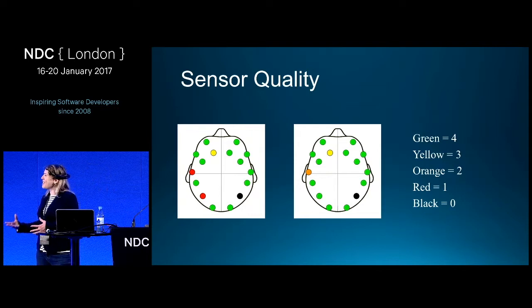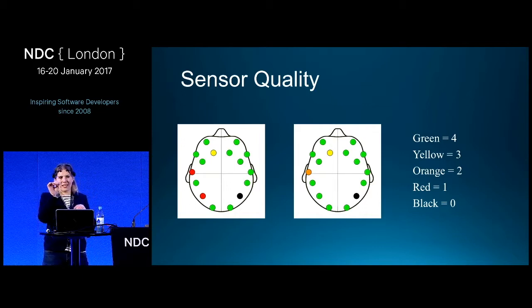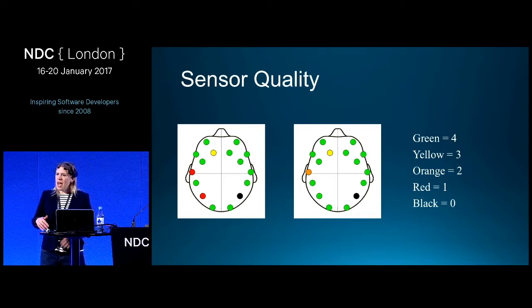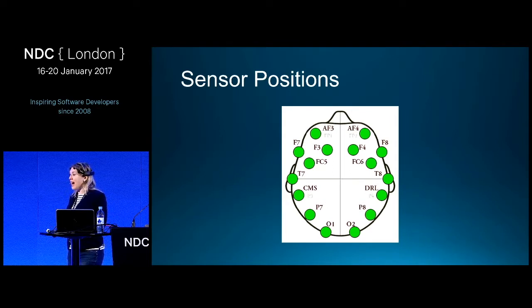All right, then the next thing you see is sensor quality. I mentioned that that was an enumeration, and there's what they map to. I grabbed two different screenshots of what this looks like. I was running last night, and I hadn't used this headset in a while, so the sensor pads had gotten really dry. I had to dump most of a bottle of this on it to get them reading nicely again. When they dry out, they go black and don't read well at all, and then you have to get them really wet to work well. But that gives you a sense. Zero, the black, is almost no signal at all, and green is the strongest level of signal, with progressive levels of degradation in between. As you saw in that Excel spreadsheet, all of that data comes through individually for each one of the nodes on my head.